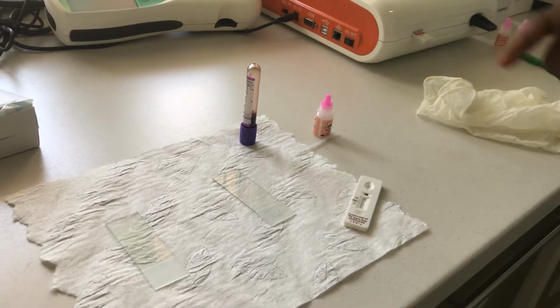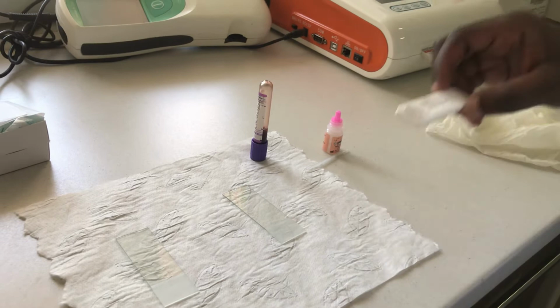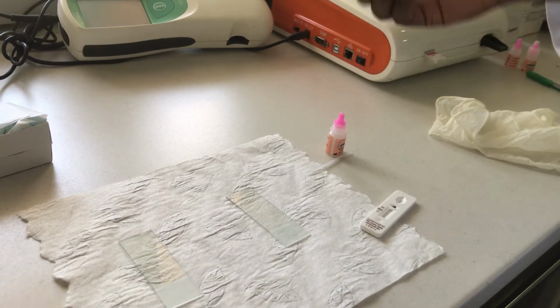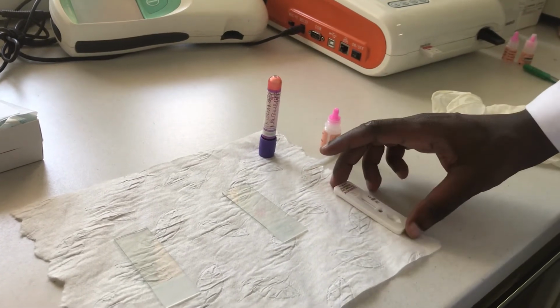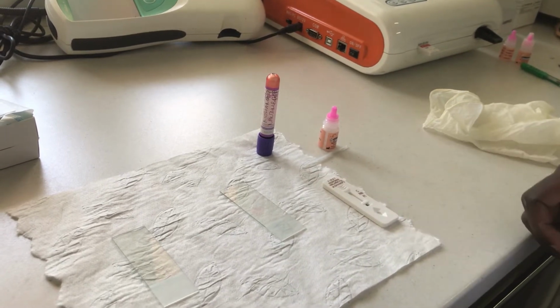It is embedded already with an antibody that, when you add your blood, which contains an antigen, it's able to capture it.